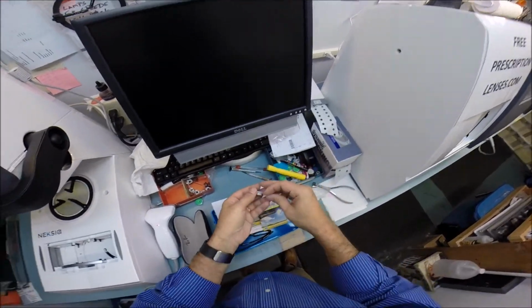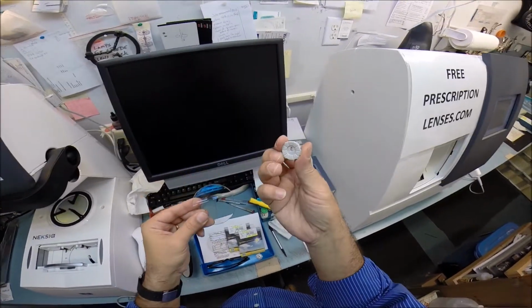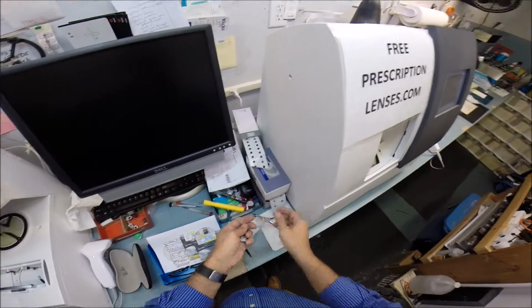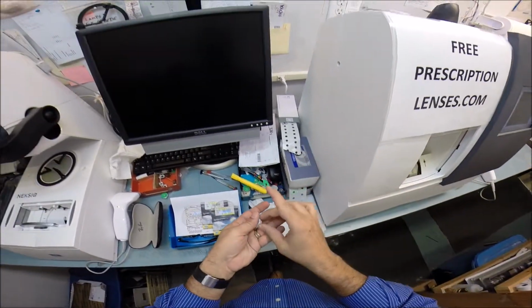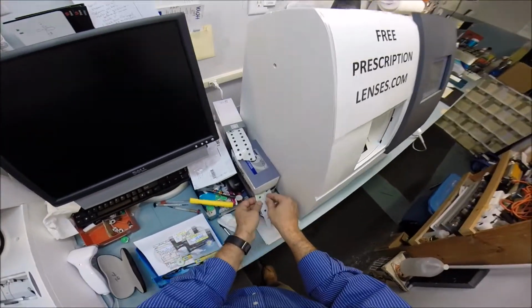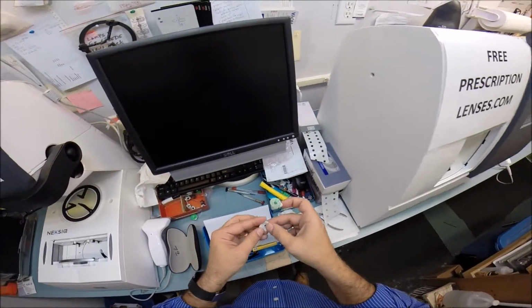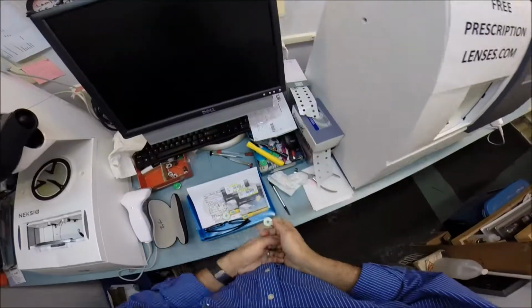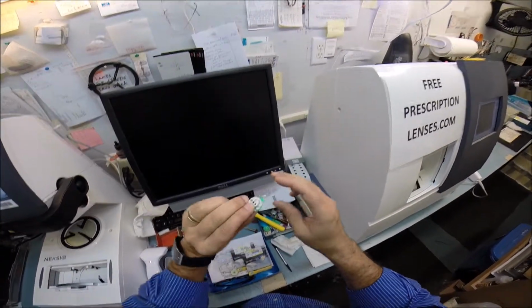Now this is called a block. This is what I need to attach to your lens while it is cutting. It's going to hold it in the machine. So I need to put a double-sided adhesive sticker. The green side is the sticky side. I'm going to stick that onto the block, leave one in there, grab a second one to do the same thing, although I already put one in there, so I guess I can take that one back out. Woohoo! It's still alive. It's trying to get away. Put the sticker on there.